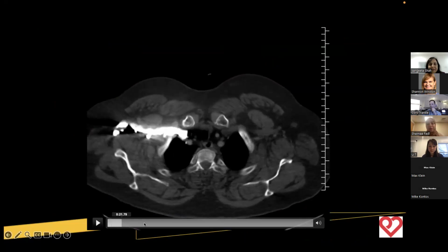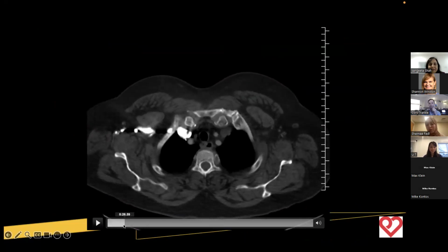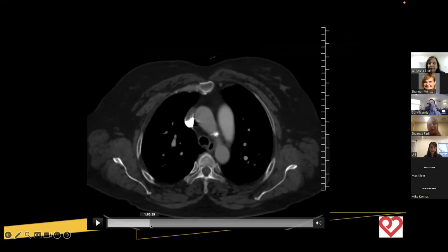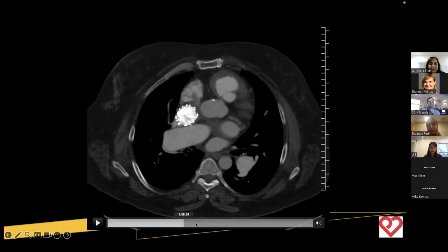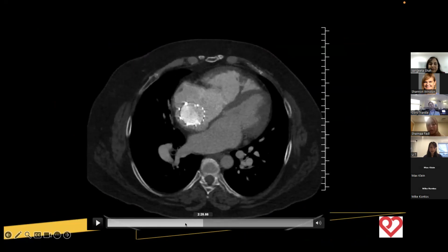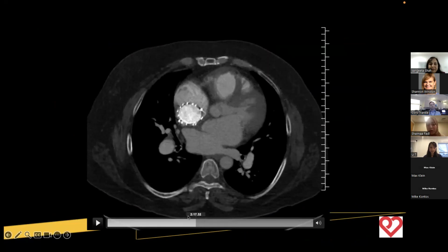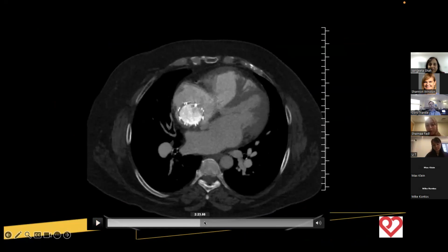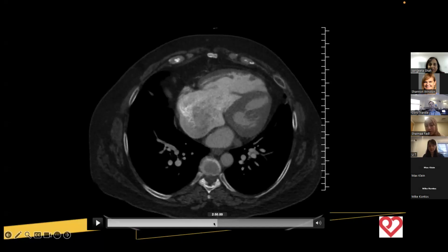Scrolling through, the patient underwent stent placement. They placed 2 stents, covered and uncovered, overlapping. If we stop here, the covered stent is aimed to close that interatrial communication and redirect the SVC. You see here the bright contrast material flowing from the SVC to the right atrium and on to the right side of the heart.